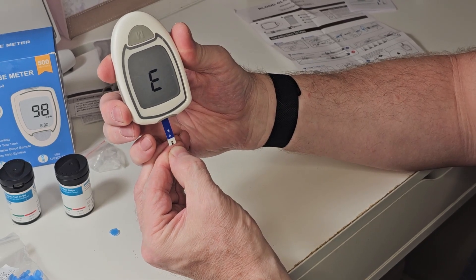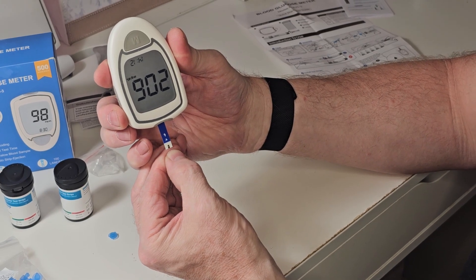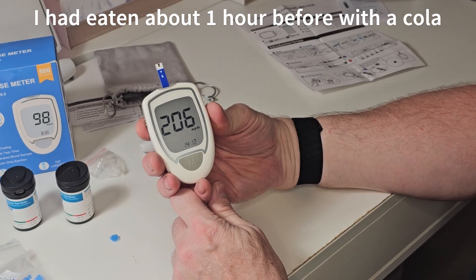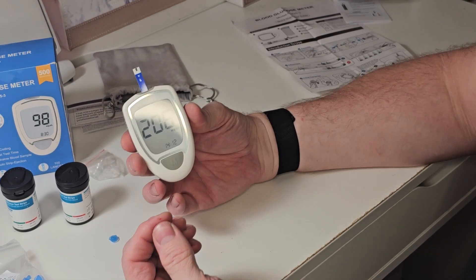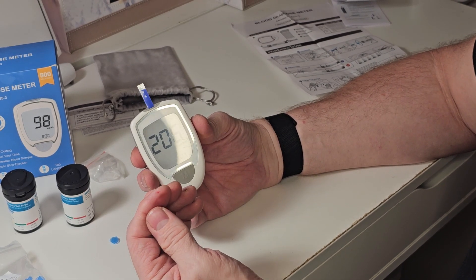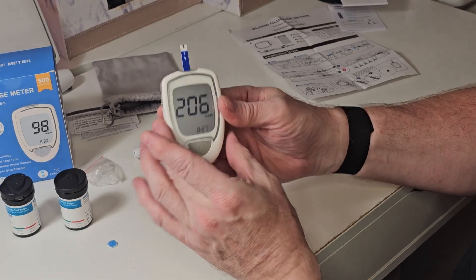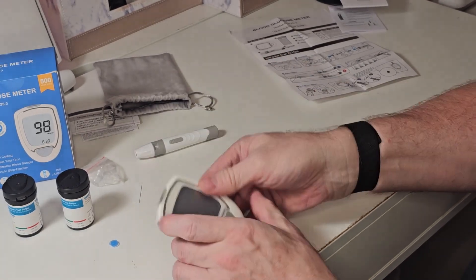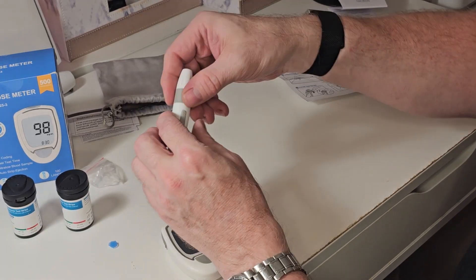The strip soaks the blood up and then that is your reading — pretty quick and easy. When you're done, make sure you wash your hands really well. That should heal up pretty quick. When you're done with your test strip, push it up and that will pop it out for disposal.